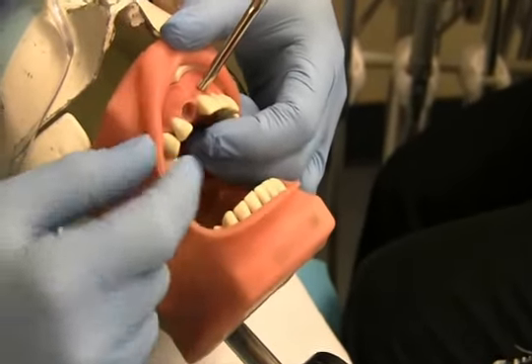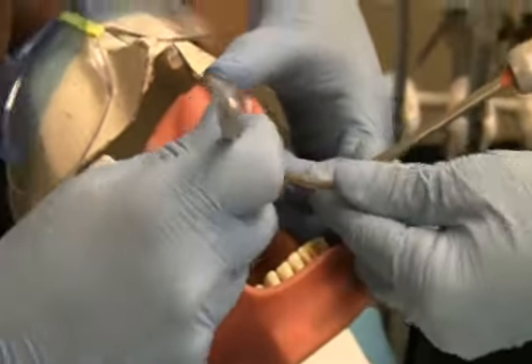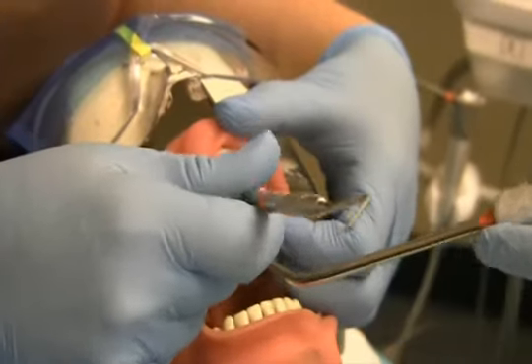She would then pass the dentist the curette. The curette is to remove any debris within the socket. If there's an abscess or any type of infected tissue, this would be removed at this time.